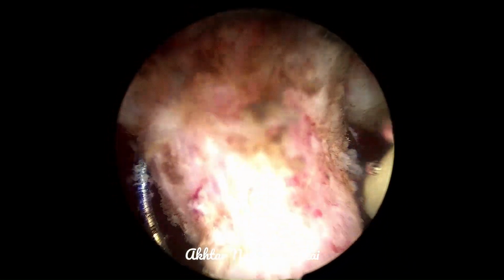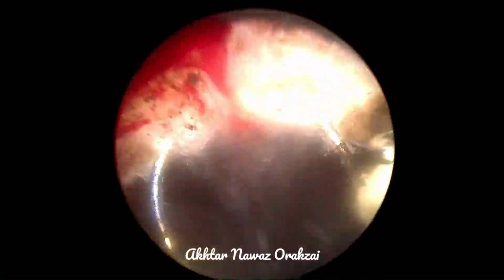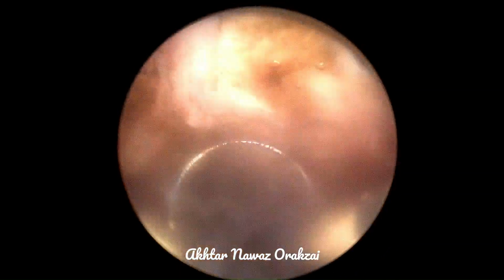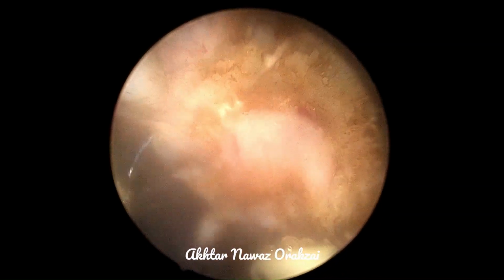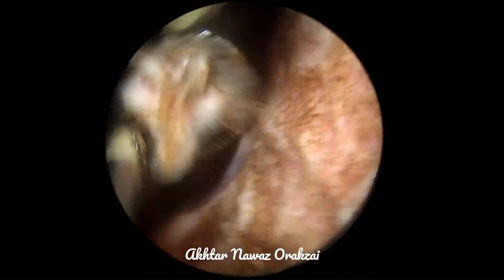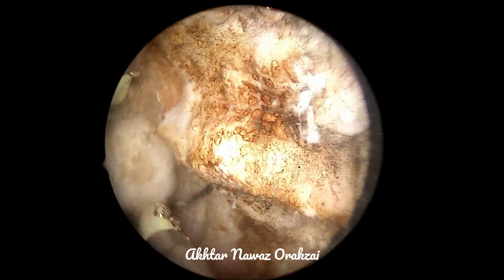Here we are resecting the anterior lobe, as in 90% of the cases there is no need to resect the anterior lobe, because the anterior lobe does not contribute to the obstructive element of the prostate. However, if it drops down, it is good to resect only the area which has dropped down, because if you resect it deep towards the capsule, one may open the prostatic venous sinuses, and then the consequences are again very dire.